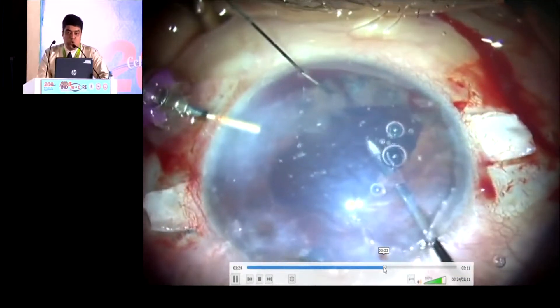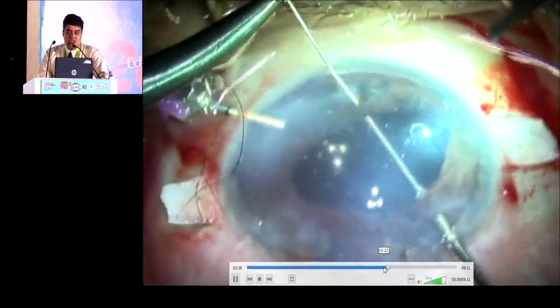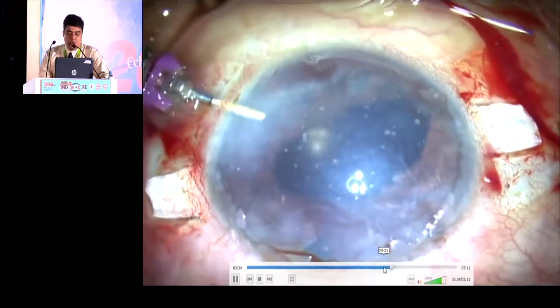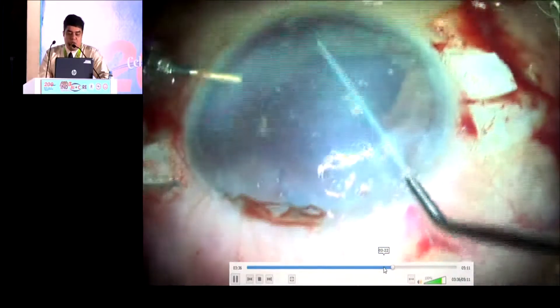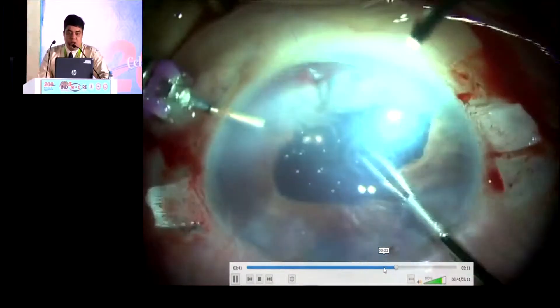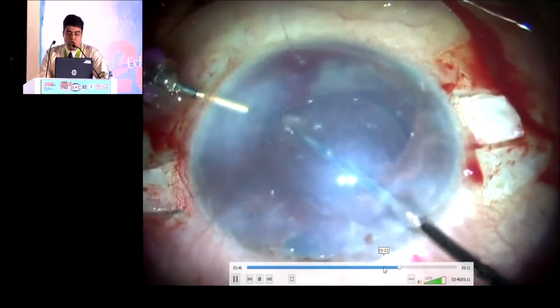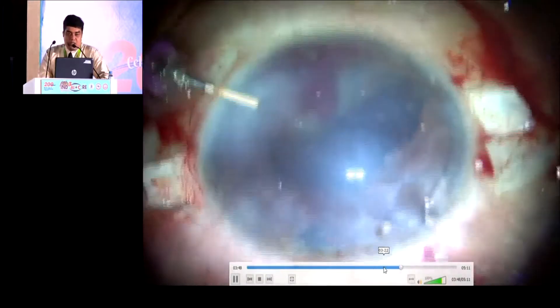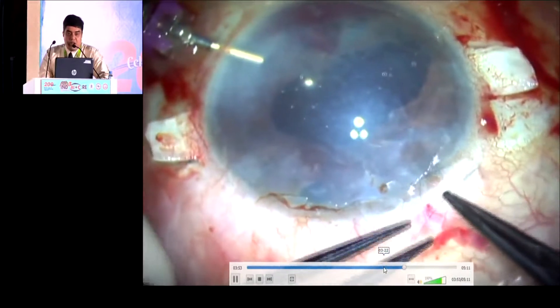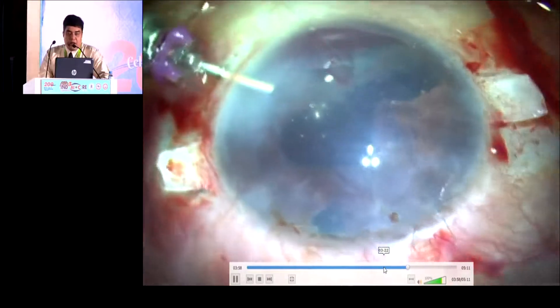The third step is that we want to do the single pass, 4-throw pupilloplasty. Through the straight needle with 10-0 nylon, we have inserted through the iris and brought it out. By the railroad technique, trying to mobilize the iris everywhere and see to that we try to get a rounded pupil. The loop is pulled in. Throughout the procedure, the Trocar AC maintainer helps us to continue with the surgery. The four loops are taken and pulled to each other to get a rounded pupil.